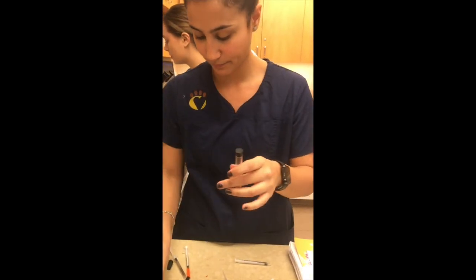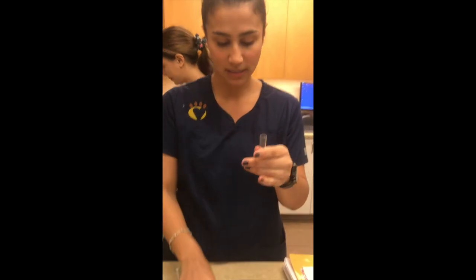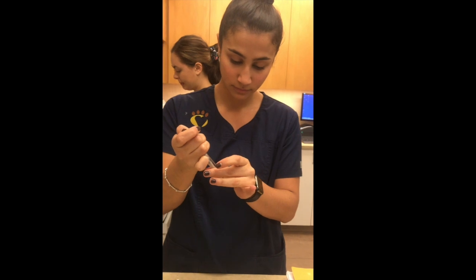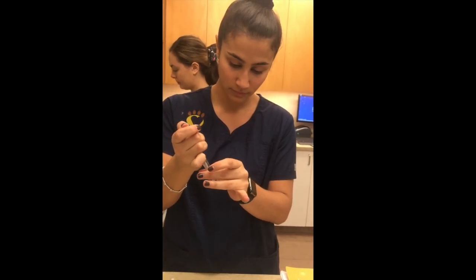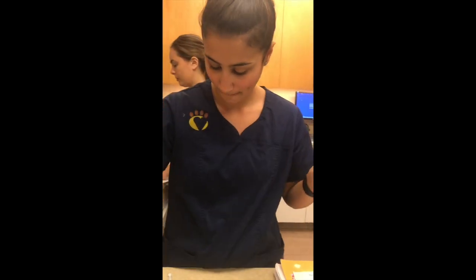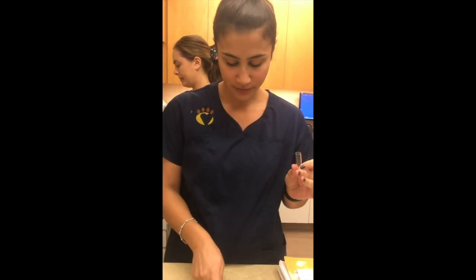Perfect. So first I'm gonna decant the rest of the supernatant. There actually wasn't too much in this one. Perfect. I'm doing the same thing, so I'm gonna take 0.02 mils of blood.